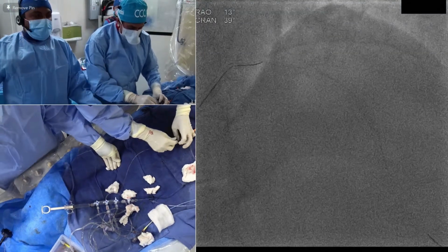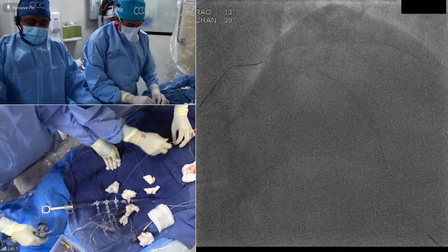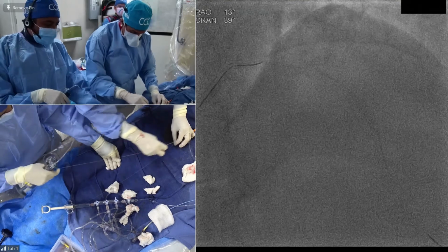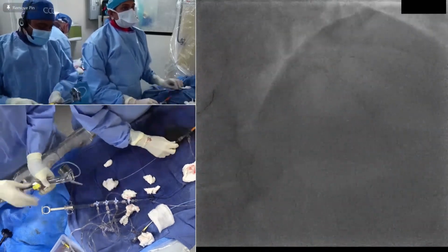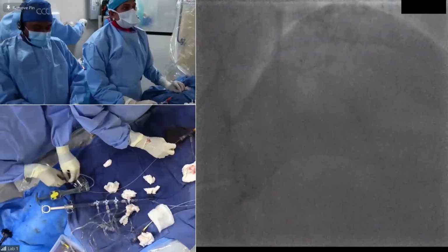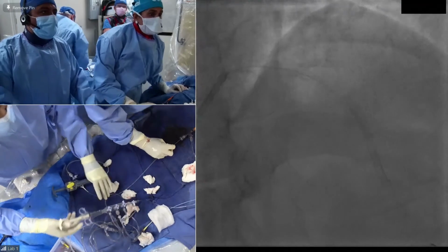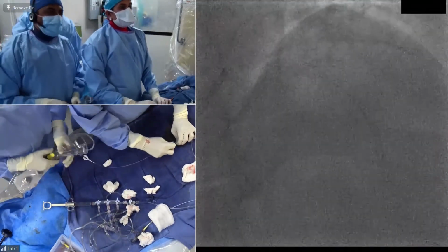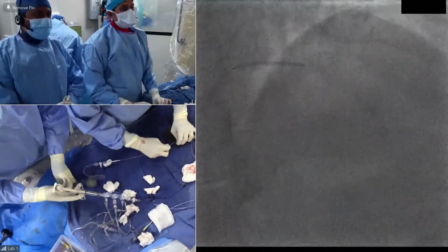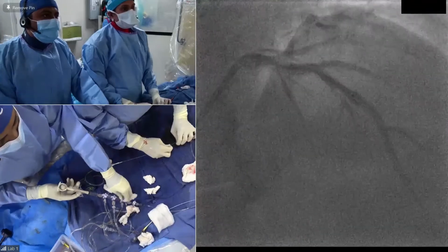So the only thing, as you can see here, let me explain: unless the stent strut is crushed, the stent that we're trying to place now may not go, because it may bump on that strut. So it's very important. Can you see the crushed stent strut? You can see it very clearly, and therefore the pathway to the LAD is open, and the stent goes in very easily.